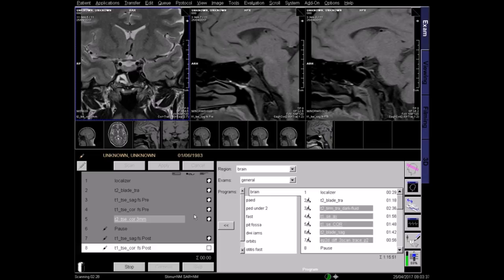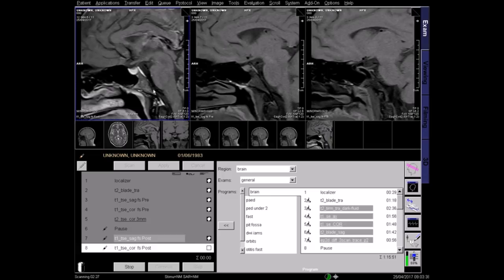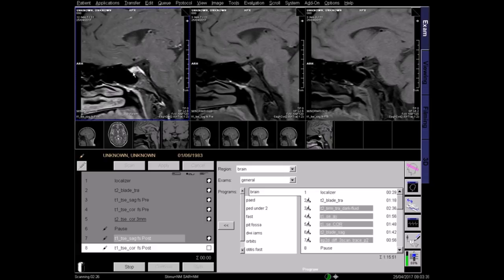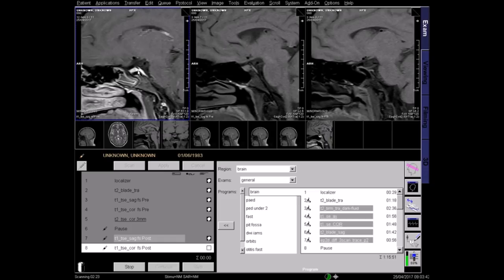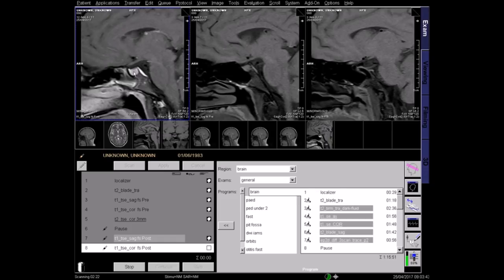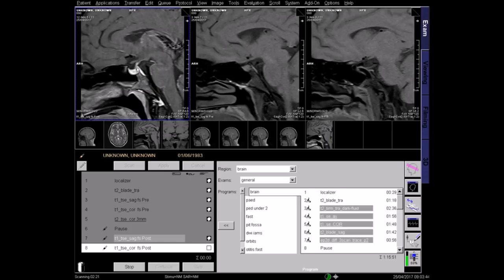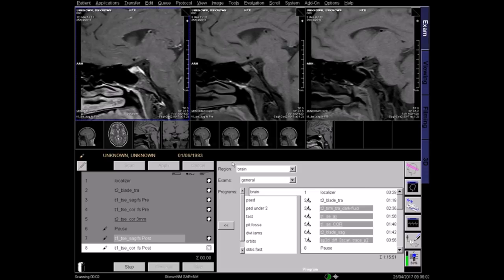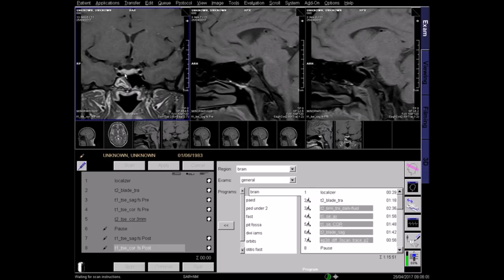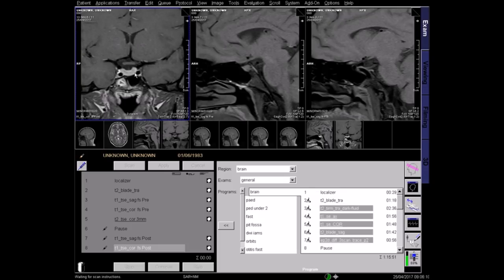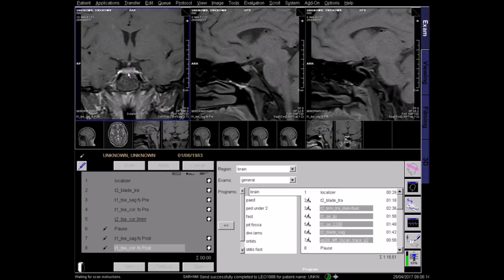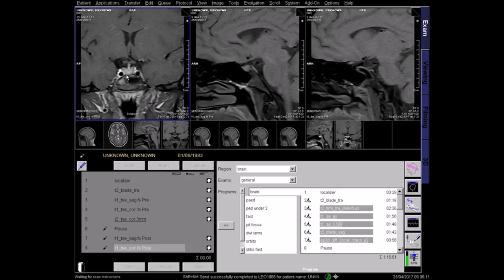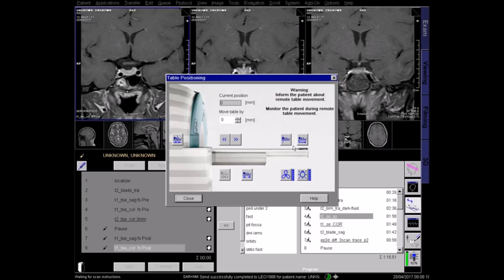Let's move on to the post-contrast images. On the T1 sagittal fat-saturated post-contrast scan, the pituitary is seen to have enhanced. The same is true on the coronal image. Gadolinium is often used to enhance the diagnostic quality of the scans, identifying abnormalities such as micro and macro pituitary adenomas.